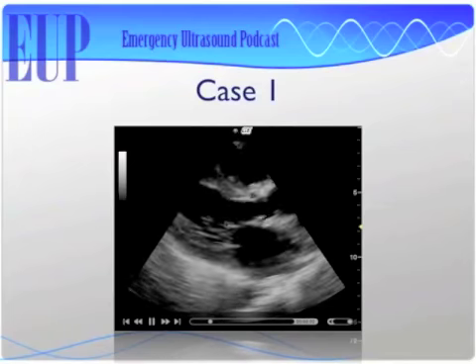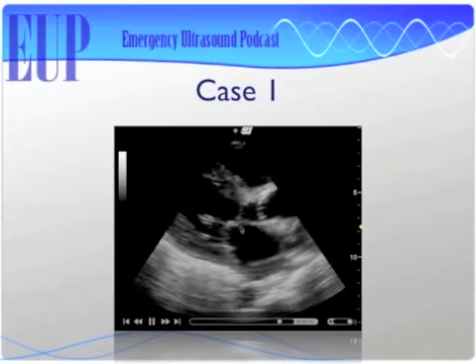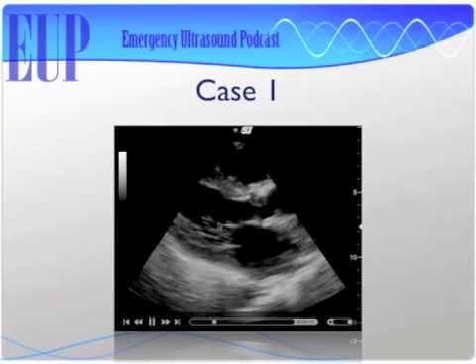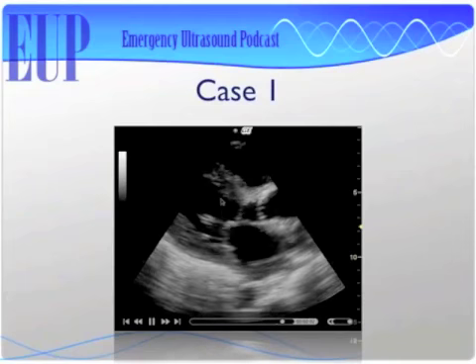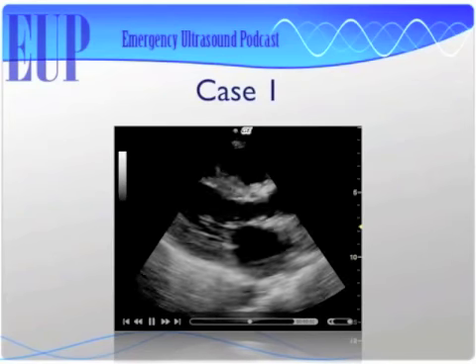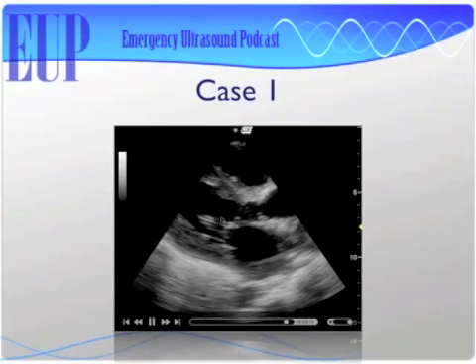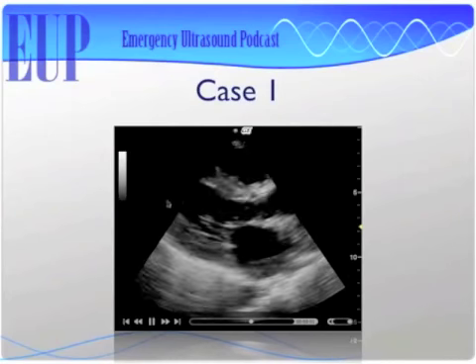That's not what I said, but yes. Okay, that's what you're getting at, though. You're putting words in my mouth. That anterior leaflet of the mitral valve isn't flapping enough and not getting close enough to that septum, and that's actually a pretty good indicator that somebody's got decreased cardiac function. So I agree with you. I think that's probably true. That just doesn't look like it's squeezing right.